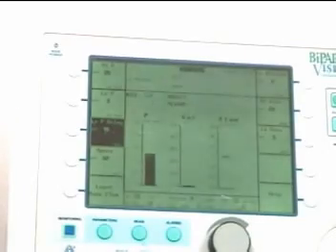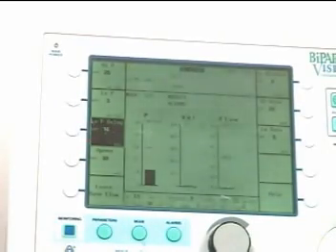Appropriate apnea is between 30 and 60 seconds. We have it at 30. That's sufficient.